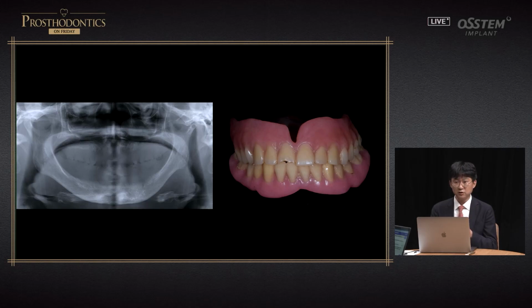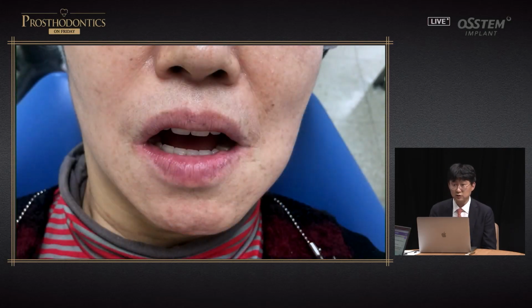The jaw is moved to the right, and we can expect more stability of the patient's jaw with the current chewing position coinciding with the deprogrammed position. By providing tissue conditioning, a denture can be fabricated for this patient.